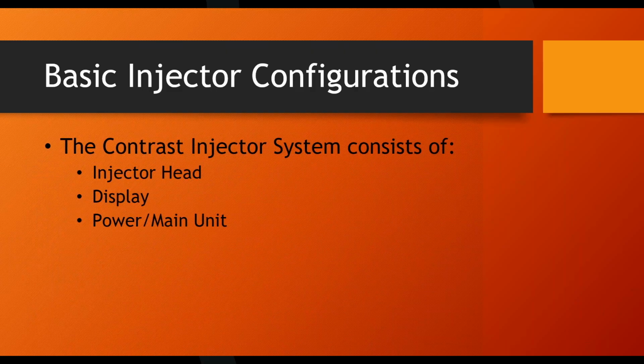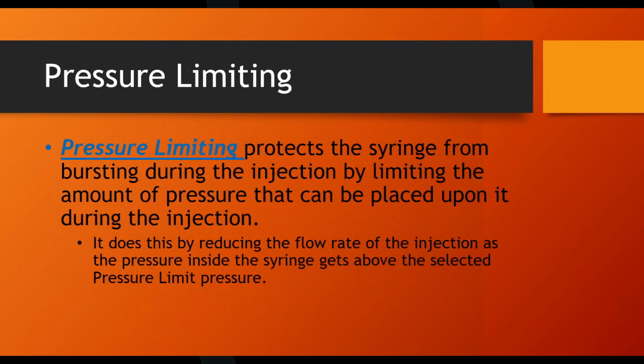Contrast injectors, all contrast injectors without exception, all right? There are 3 components to every single contrast injector. There's the head right here, there's the display, which I've been doing, and then behind it is the white box, and that's the power supply. All contrast injectors, CT, MR, angio, make, model, manufacturer, doesn't matter. 3 components: head, display, power supply.